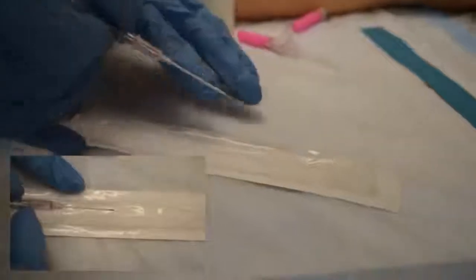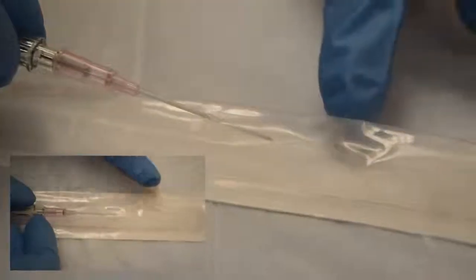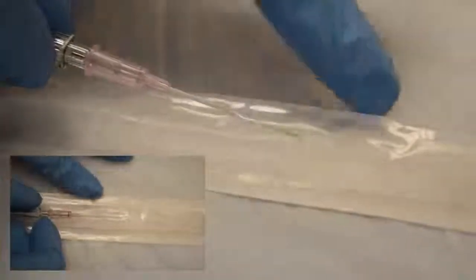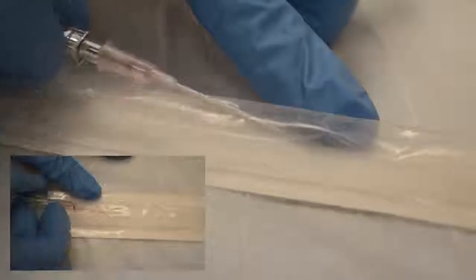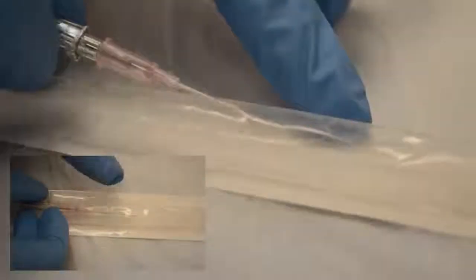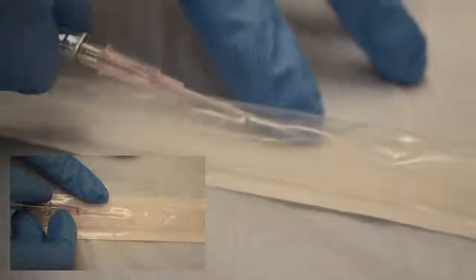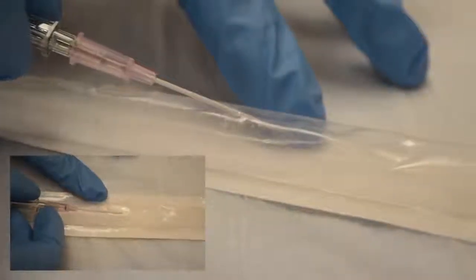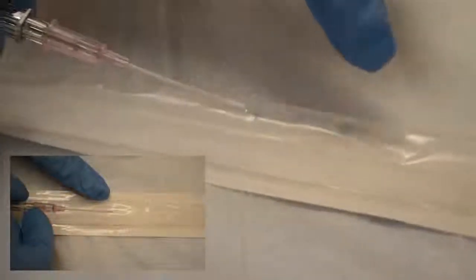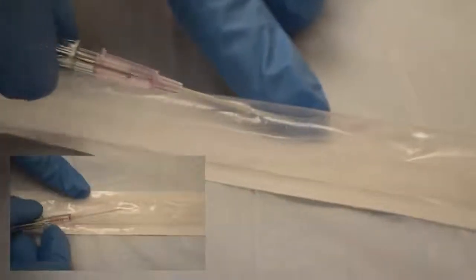Okay? So let's say we've poked and we're underneath the skin and oh, our vein is all the way over here. Instead of moving it to the side with half of your needle in, think about how much skin and tissue you're shearing and how much pain you're causing your patient. That's called fishing. What we want to do is draw the needle back until it's almost out of the surface of the skin, and then move your hand to redirect and then go back in.